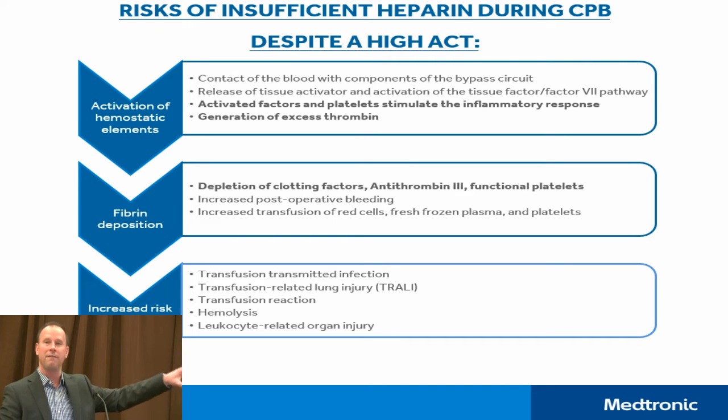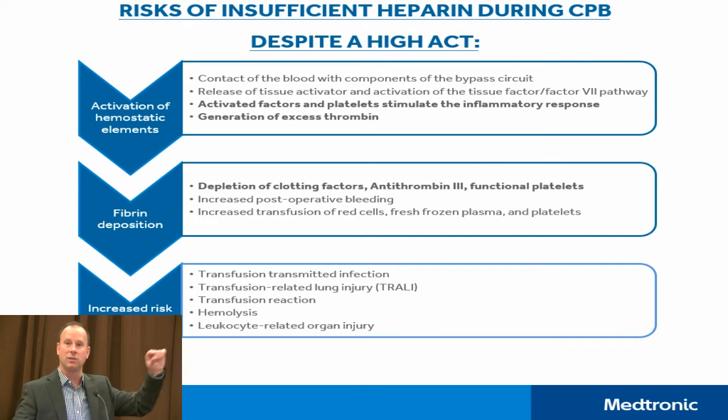So this is the benefit of doing the heparin level. This isn't so much a dosing benefit as it is a benefit during the case when you're running your ACTs high, but that blue or tan cartridge is calling for a little bit more heparin. You're like, wow, 625 ACT, should I? Well, by giving that small increment of heparin, this is what you're handling behind the scenes.